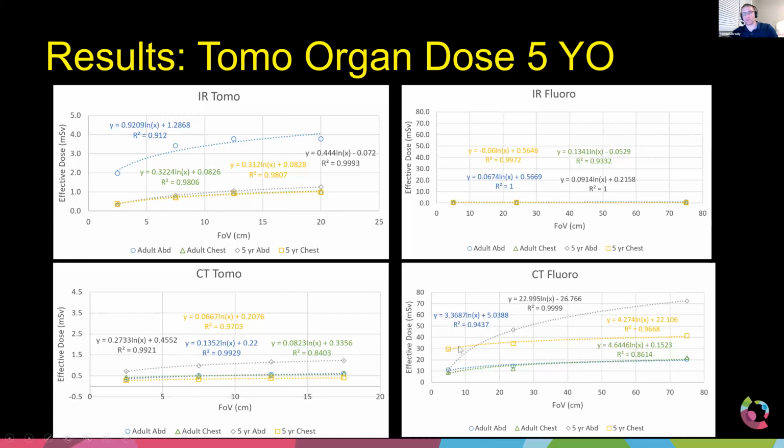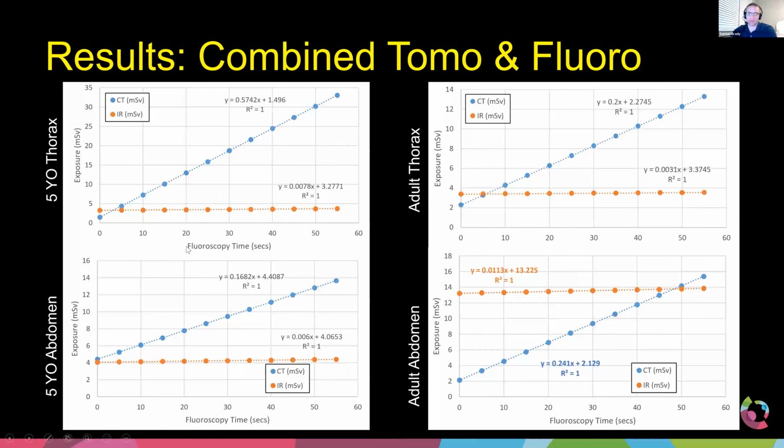That's just because in fluoro you're doing low, real time, stationary, but in CT you're making about 1,000 or so images, even though it's a relatively low mA, so you can create a volume image. So what we did is I created these regression models and combined them together so that I could create one empirical model. What this allows me to do now is pick however many cone beam spins that I'll do on my C-arm fluoro, which is shown here in orange.